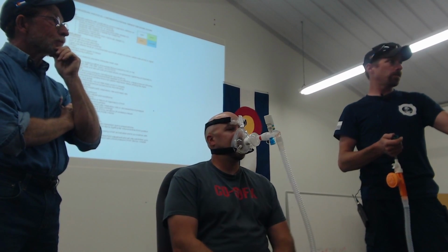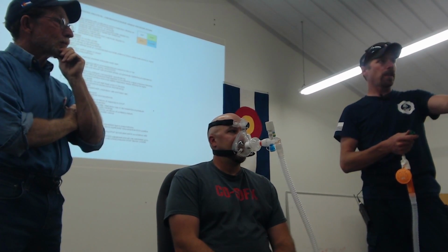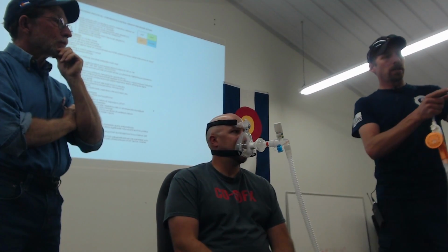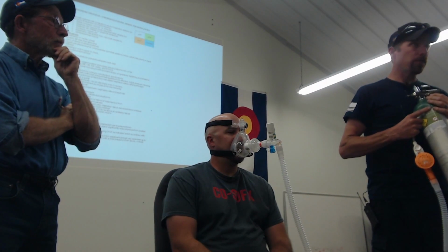Tighten it down, just thumb tight. It's got an O-ring, don't have to get crazy. Verify your gauge, do all your normal checks, make sure you're not leaking here. Turn your bottle on.